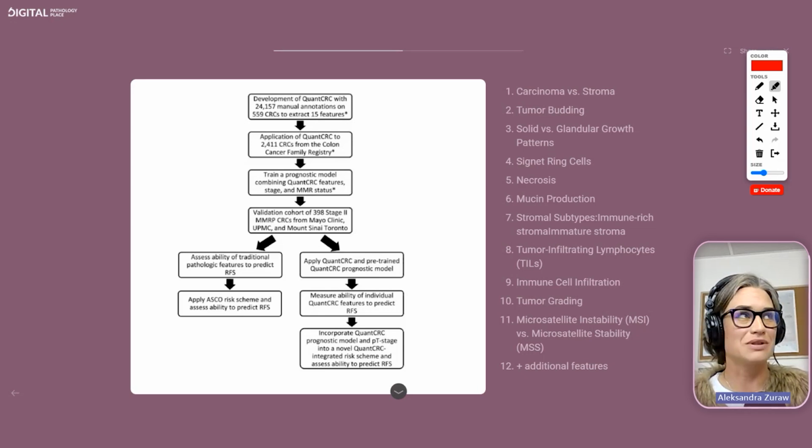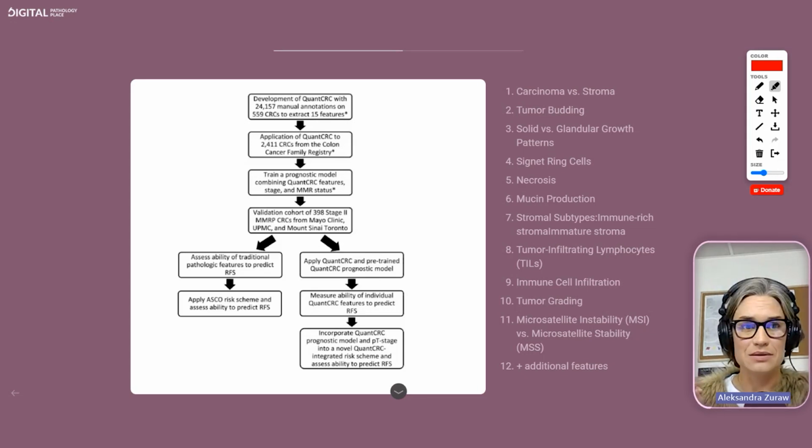That was for IHC quantification of lymphocytes in some tumor entities. Around 2016, then in 2019, this made it into commercial software. The previous way of doing image analysis was the classical computer vision approach, rule-based, whereas this one is example-based and based on deep learning architecture. So whenever you hear deep learning, that's where you can give examples.